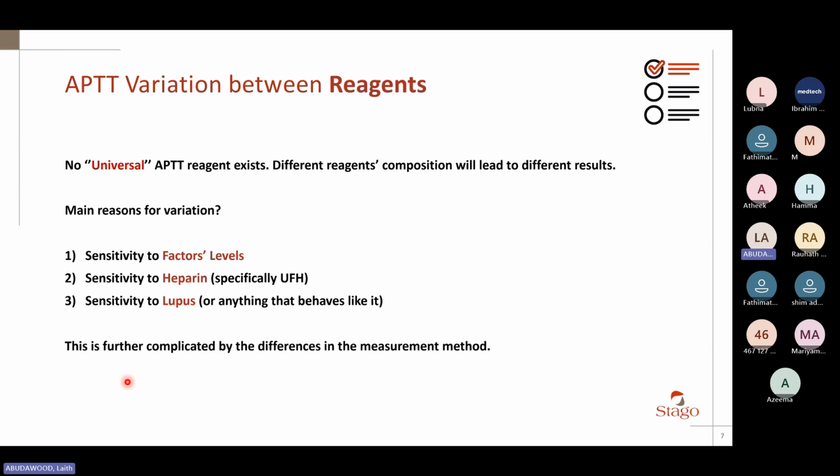For APTT, no such thing as a universal APTT reagent exists. No one who knows what they're talking about can tell you this APTT reagent is suitable for everything. That simply does not exist. It's physically impossible. Why am I saying that?